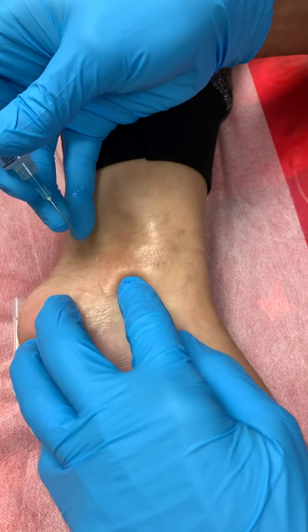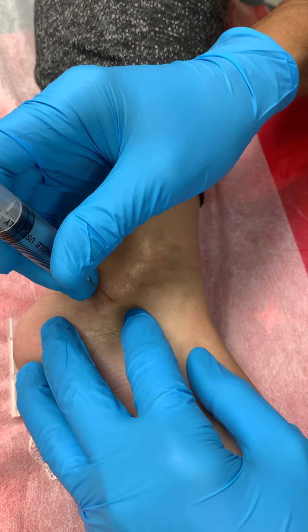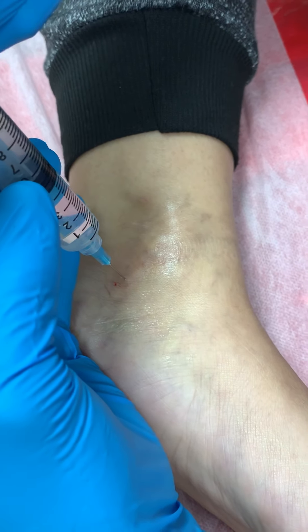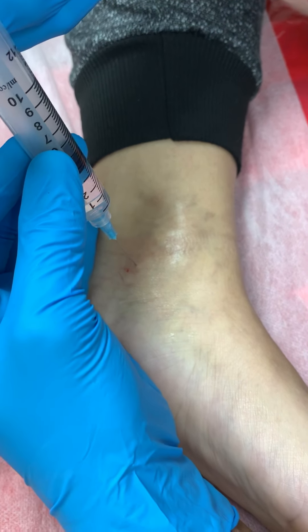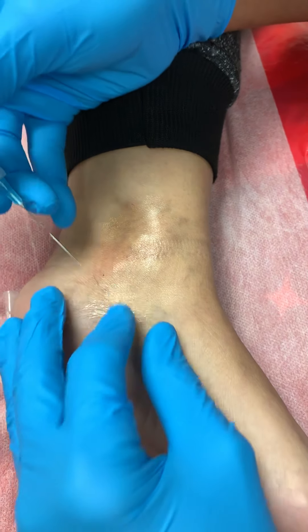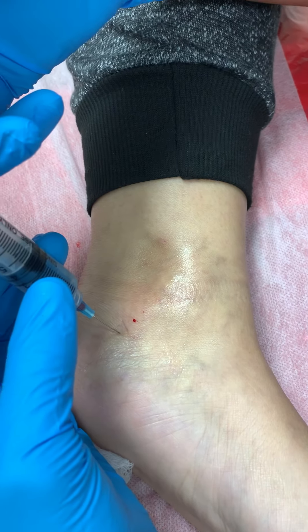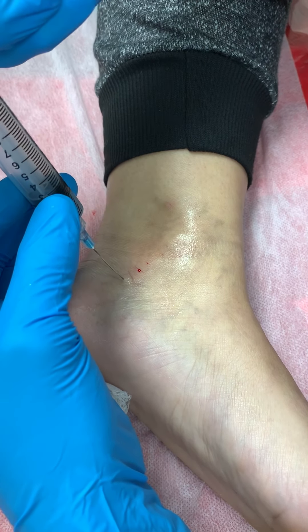As it moves away to the bottom of the foot, it separates into two little bunny ears: the medial plantar and the lateral plantar. We're just about to perform minimally invasive surgery on this patient and we're numbing the entire bottom of the foot. The only way to accomplish this is exactly what Dr. Nunez is doing. It's very important because there are other important neurovascular structures — veins, arteries, the main artery to the bottom of the foot — to be very mindful of.